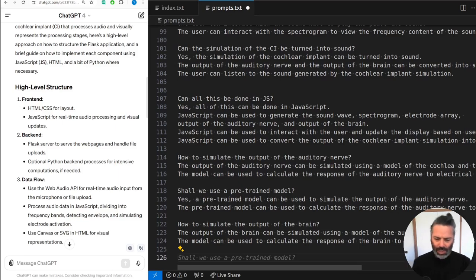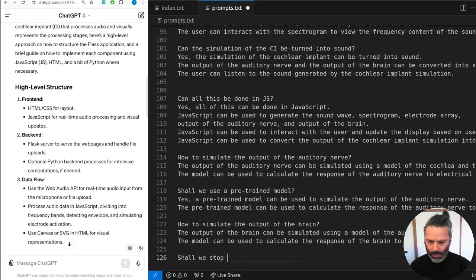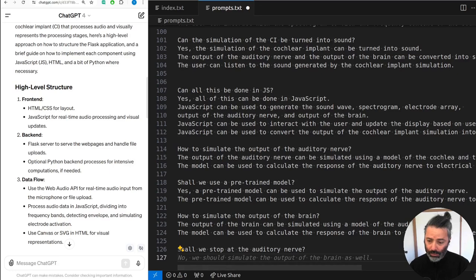Yeah, so this way it just starts repeating over itself. There's no other options. My question actually was, shall we stop? Yeah, the auditory nerve is interesting. Obviously each one of those will be its own application, so it gets quite complicated. Shall we stop? No, we should simulate the output of the brain.